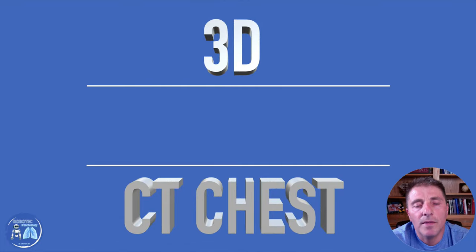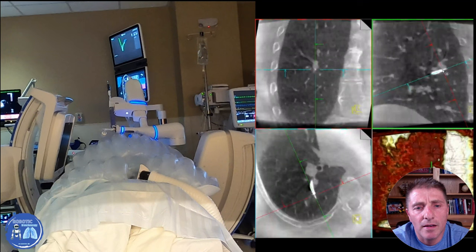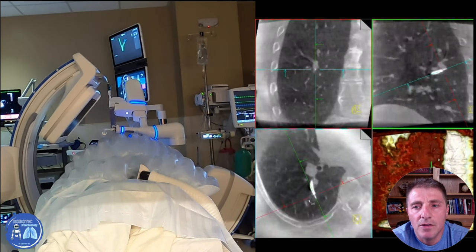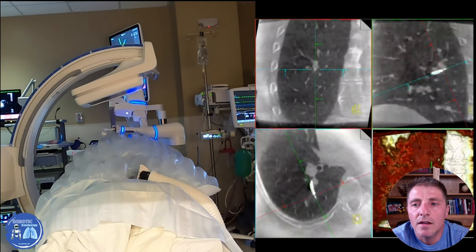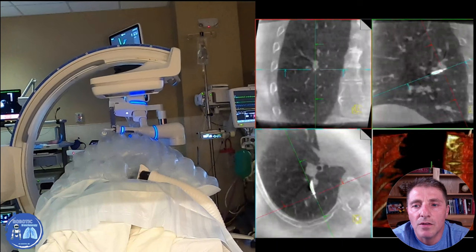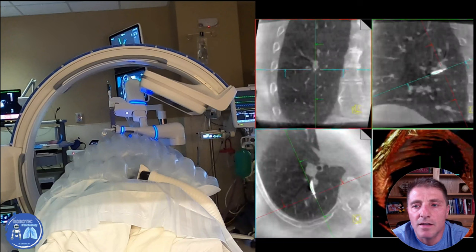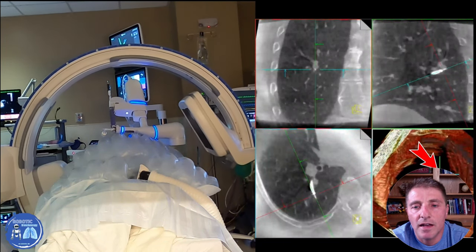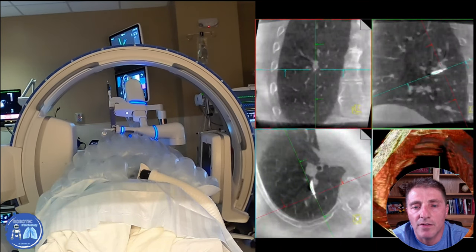Another confirmation tool we use is a 3D CT scan performed while the patient is in the procedure. We perform a spin of the CT scan to help us find where our catheter is and how close it is to the target. As you see in this example, the CT scan done during the procedure confirms that we are in the nodule we were going after.